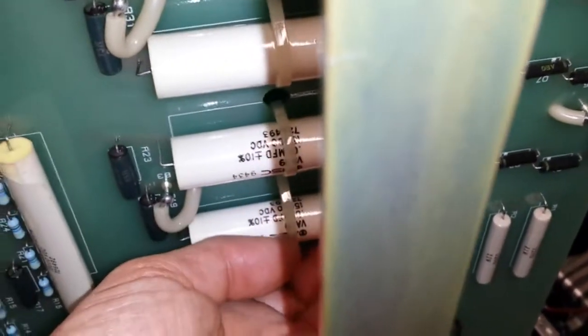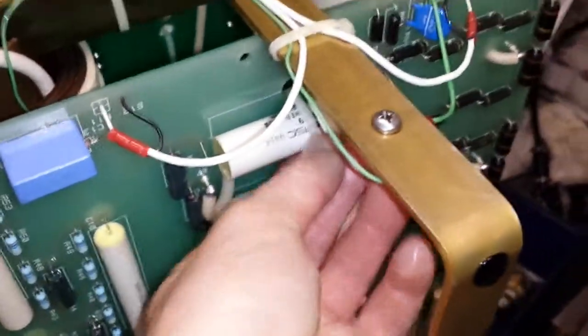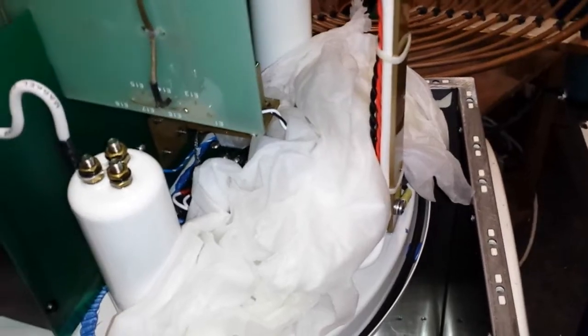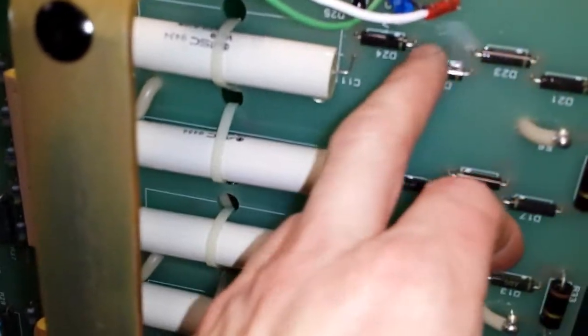Oh, 0.1 microfarads. MFD. And the resistors on it are 15 ohms at 5% tolerance, and these are 120 ohms, and they're 11 watts. And these diodes will probably be 10 kV each or something. Each one of these will be.